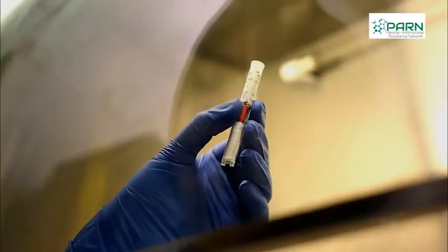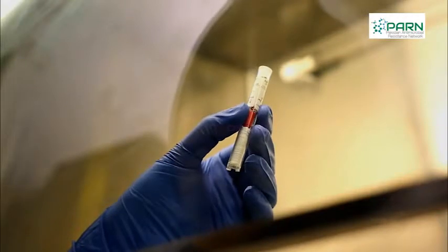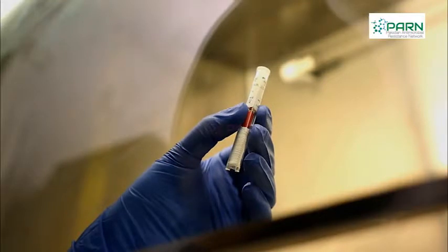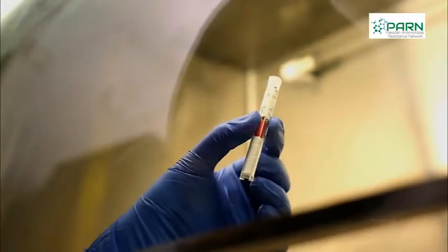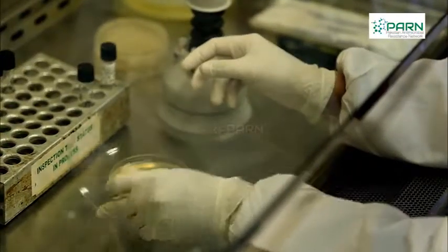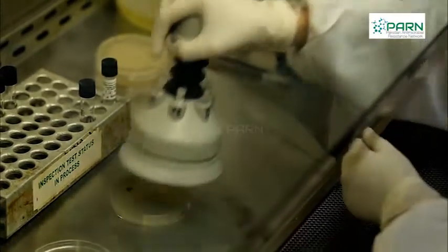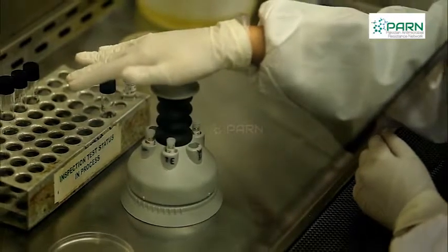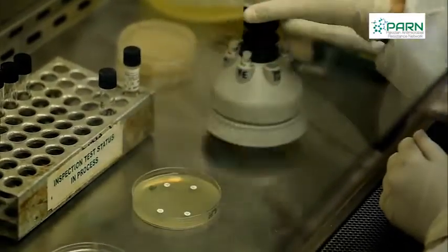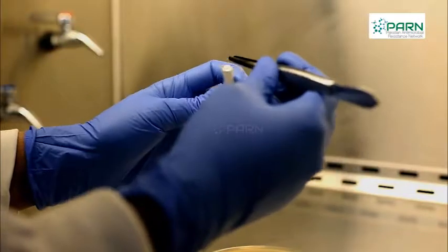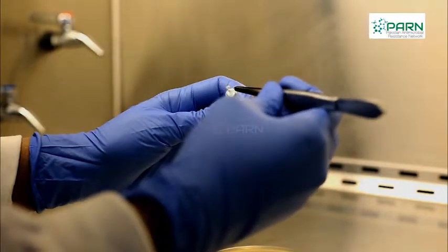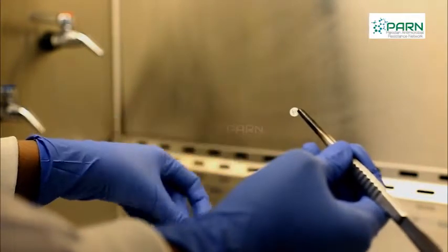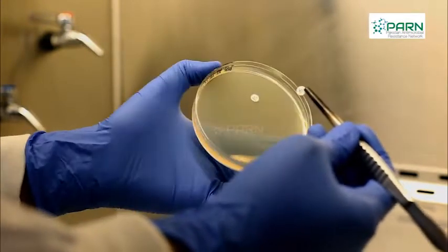Take antibiotic discs out of the refrigerator and use within 30 minutes. Do not leave them out for longer. If using the disc dispenser, place the dispenser over the agar plate and press the plunger to dispense the discs. Alternatively, if a disc dispenser is not available, add discs one at a time using forceps by firmly pressing the discs against the agar surface.